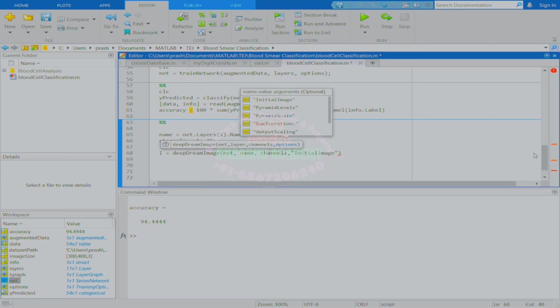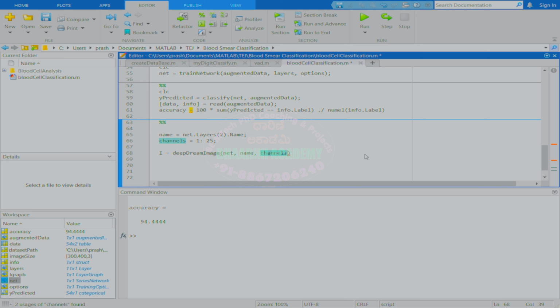All right, so let's just go with this. So let me see whether I can add some more points. Actually, there are so many things we can specify, right? Let's run this as it is, and then we'll see. Okay, so I will not go with any other specifications. So I created an I.